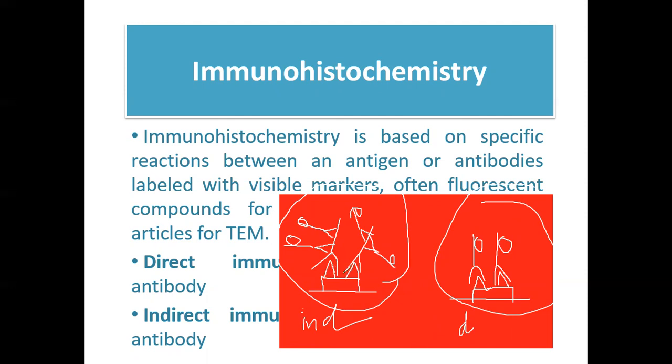Isipin mo yon, pareho sila dalawang antigen, pero yung intensity ng result or indication ng positive result, mas intense dito kay indirect. Kasi kung mapapansin mo, meron ka na ngayong total of 4 or pwedeng madami pang kumabit dyan, okay, na secondary antibodies. Okay? So, madaming fluorochrome labels kang makikita.